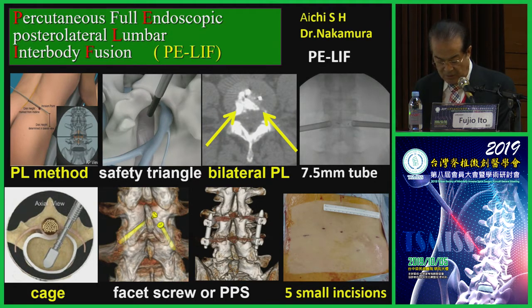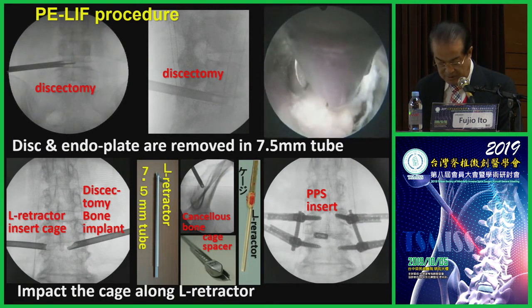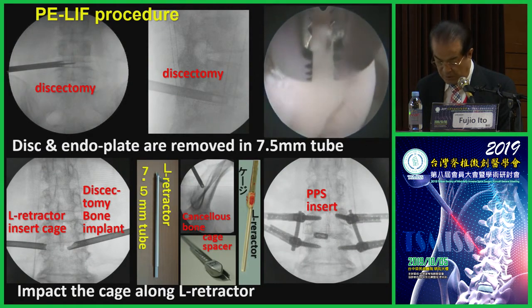In case of less instability, we can use 2 facet screws requiring tiny incisions. However, in case of much instability, such as spondylolisthesis, it needs to be fixed using more stable pedicle screws. Total discectomy is performed.